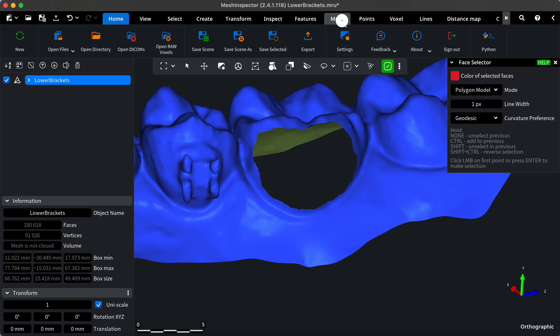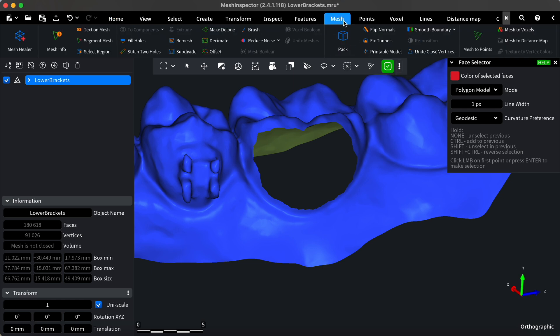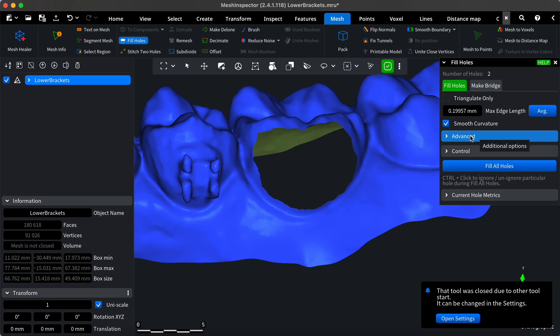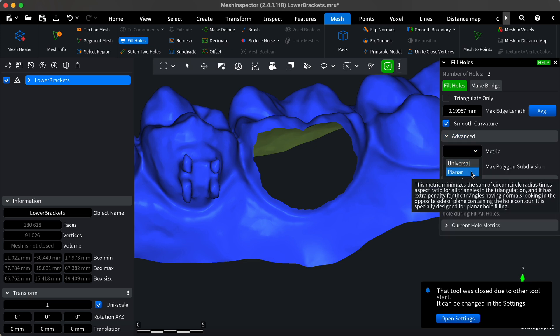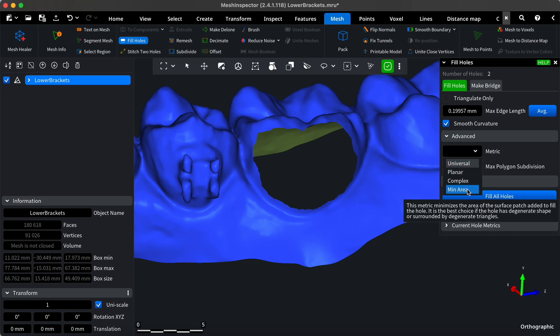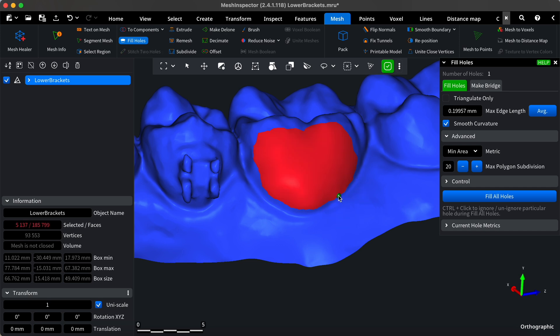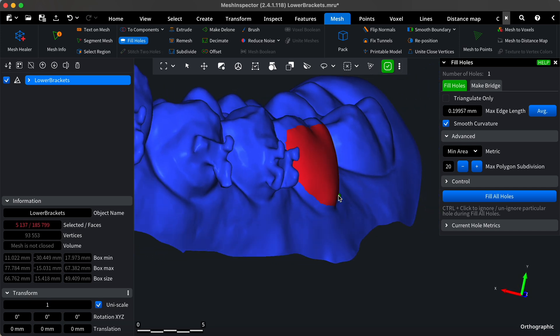Now, we'll fill the resulting hole using the fill holes tool in the mesh tab. Ensure the smooth curvature mode is activated and use the minimum area metric prioritization for hole filling. Activate the tool, point to the hole, and click on it when it turns red. Observe the result.